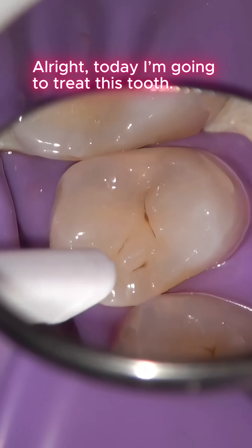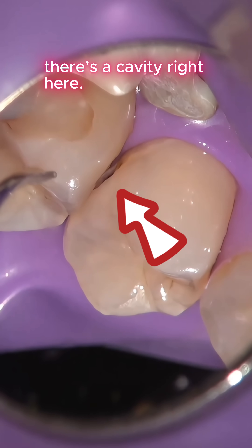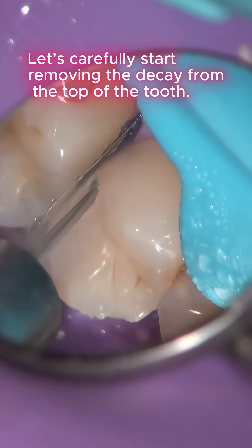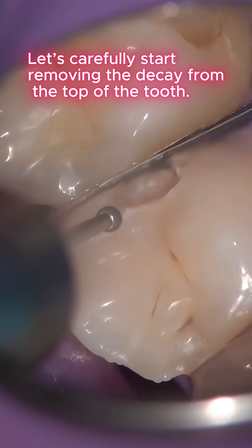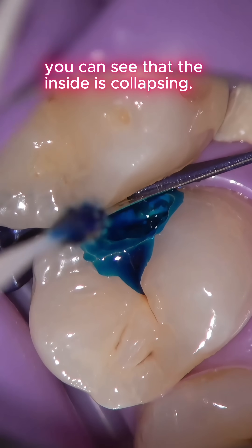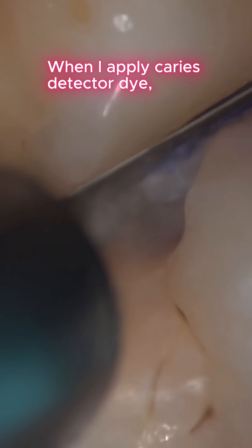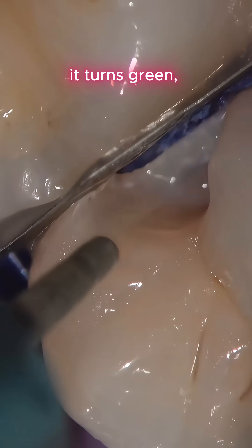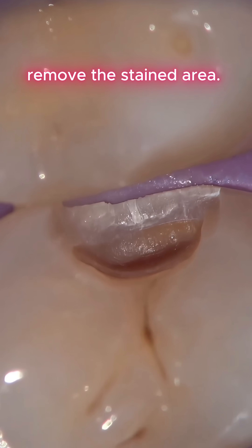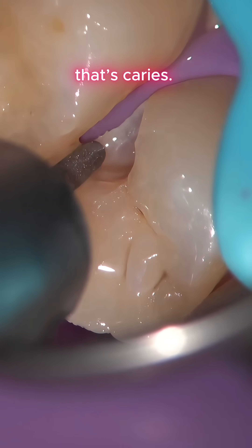Today I'm going to treat this tooth. If you look closely, there's a cavity right here. I carefully start removing the decay from the top of the tooth. As I continue drilling, you can see that the inside is collapsing. When I apply caries detector dye, it turns green, so I carefully and gently remove the stained area. The inner part has turned brown — that's caries.